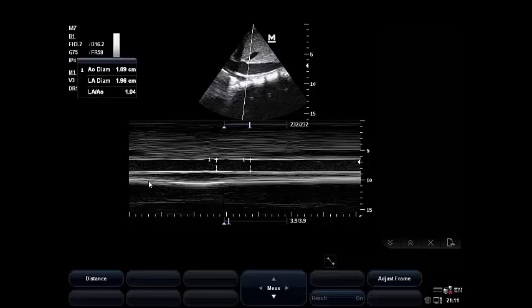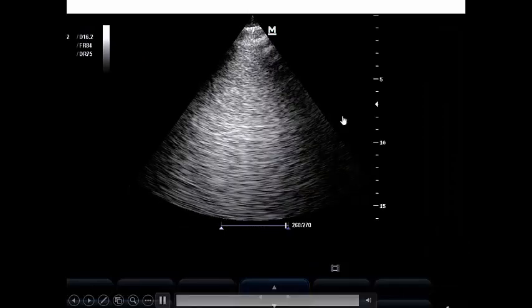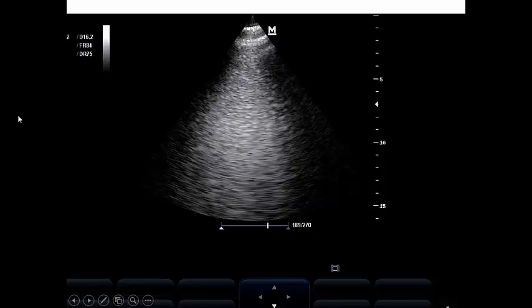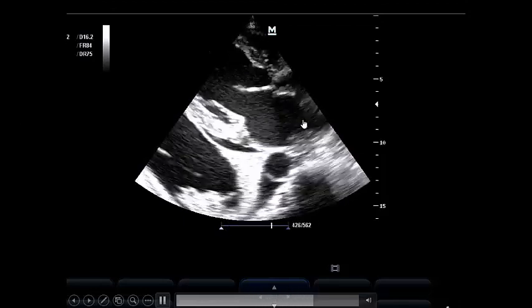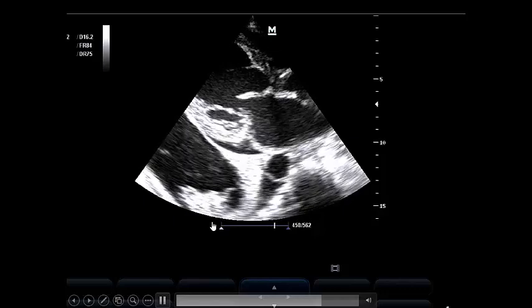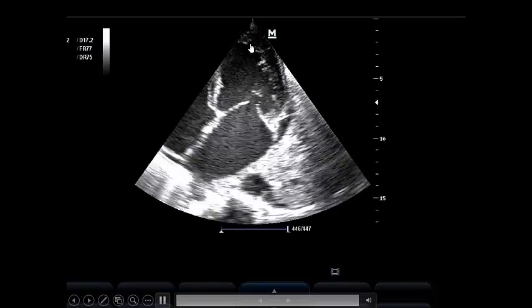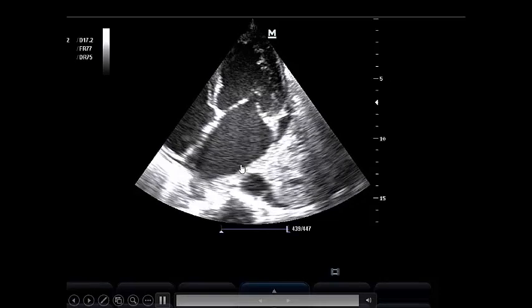Inferior vena cava is full, non-distensible. We put the probe in the lung, seen pleura, homogenous B-lines, going with cardiogenic pulmonary edema. Look to the heart, parasternal long axis view: distended left atrium, contractility about 40%, and there is effusion here. This is the four chamber view, ballooning left atrium, and contractility here seems to be better than the long axis view, about 45%.